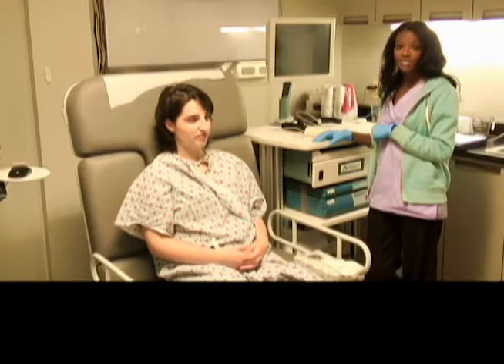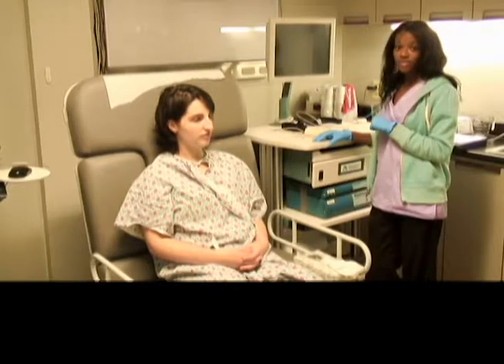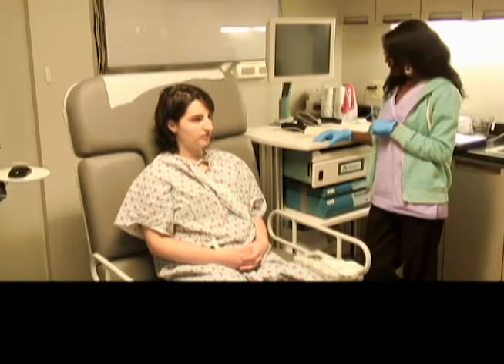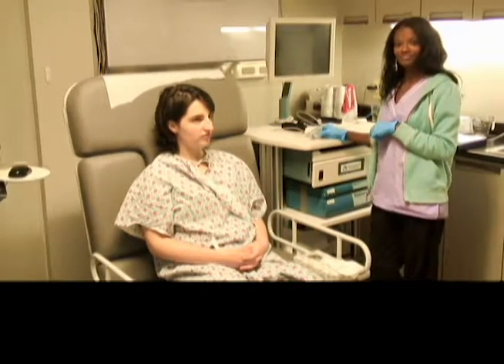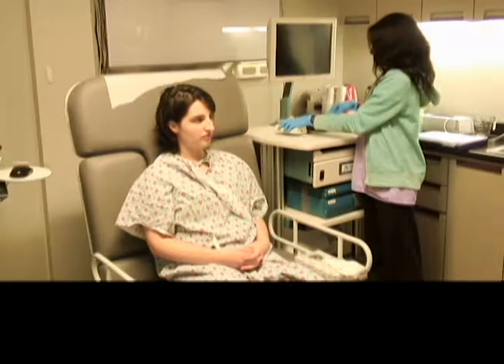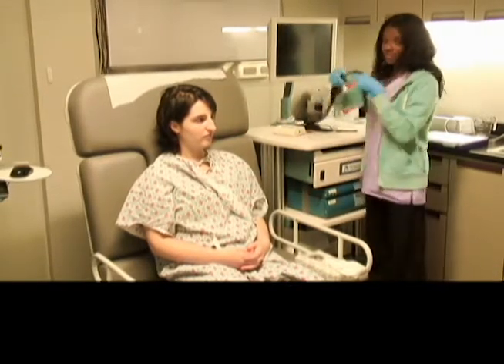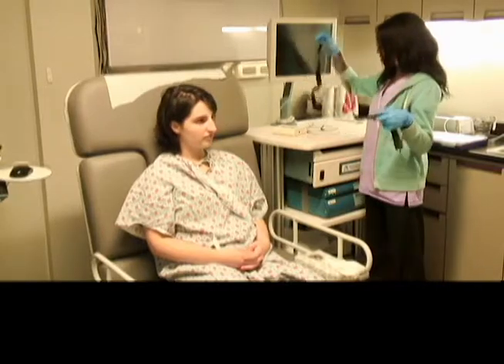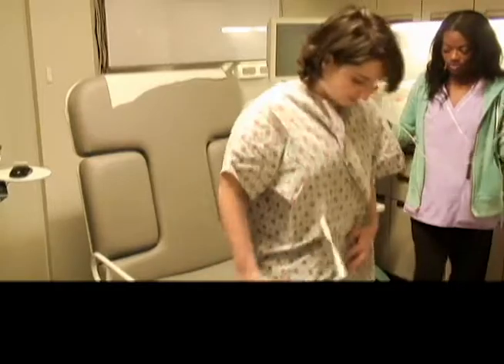The patient typically comes in with loose clothing. They are told not to wear any perfumes or lotions, and we can now put the equipment on. Alright, first and foremost, we start with the respiratory belt. So I'm going to instruct the patient to stand up and turn with your back to me.